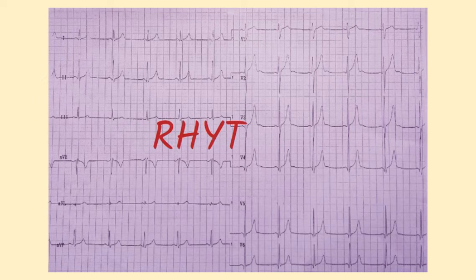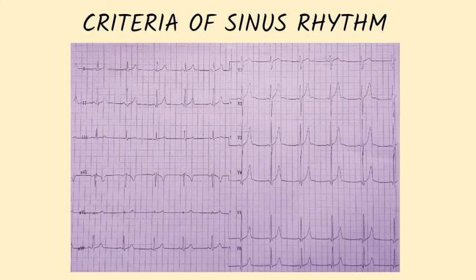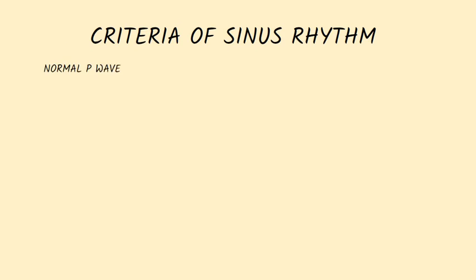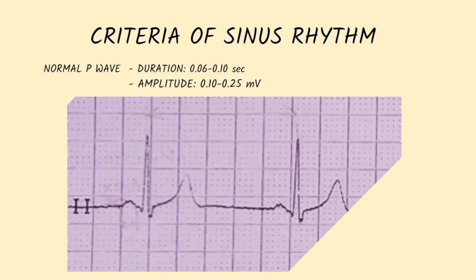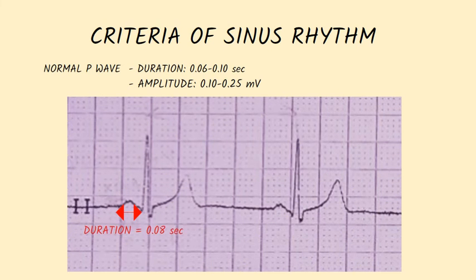When reading an ECG, you have to decide whether the heart's rhythm is normal or not. The sinus rhythm is defined by the following criteria on an ECG: the presence of a P wave in all leads, which is positive in most leads, excepting AVR where it is negative. The duration of a normal P wave ranges from 0.06 to 0.10 seconds and the amplitude ranges from 0.10 to 0.25 mV. In our case, the duration is 0.08 seconds and the amplitude is 0.10 mV.